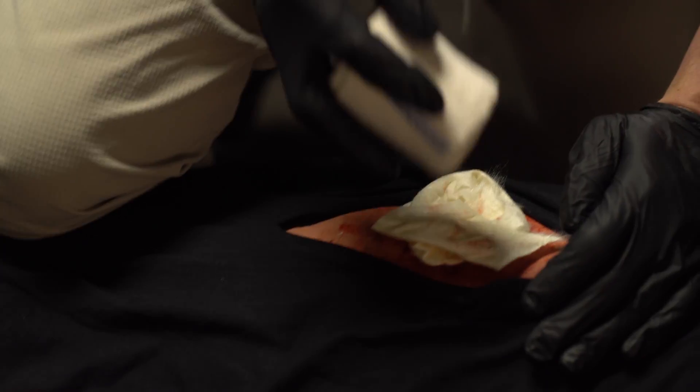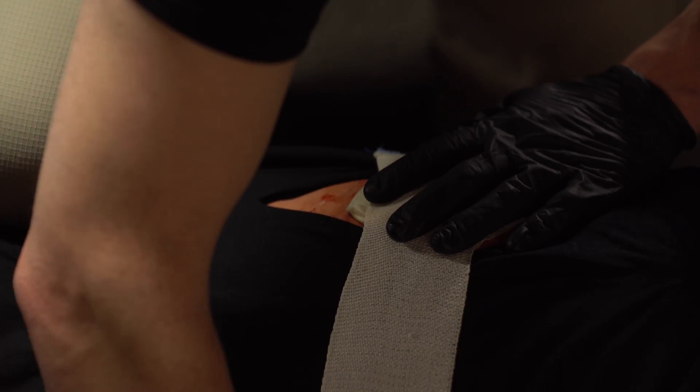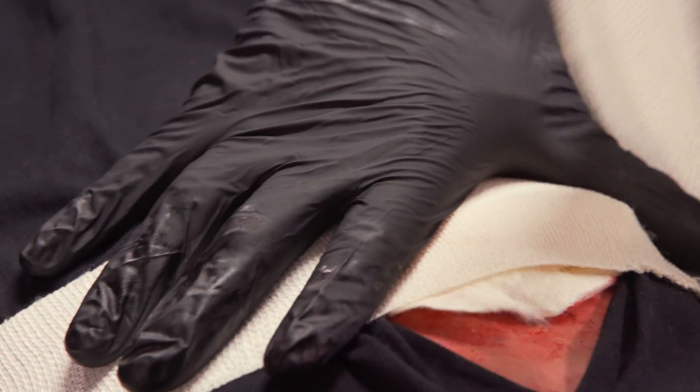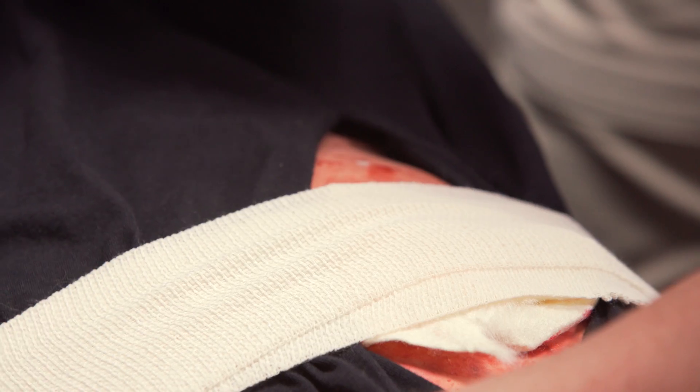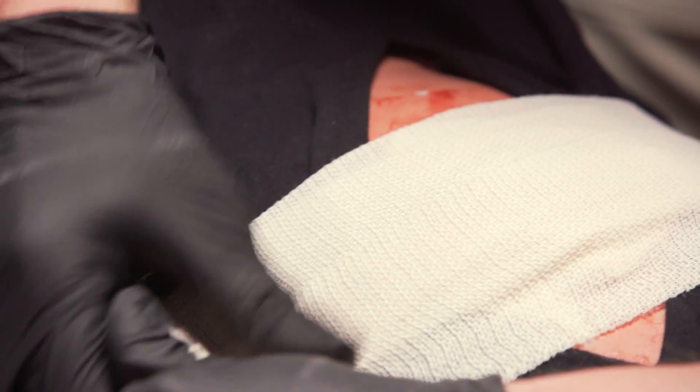If bleeding persists, attempt to add more packing if possible. Apply additional direct pressure for 3 more minutes and add a compression dressing. Should bleeding continue, additional measures such as the SAM-XT extremity tourniquet above the wound or a SAM junctional tourniquet may be needed. Apply until bleeding stops and expedite transfer to a definitive care facility.